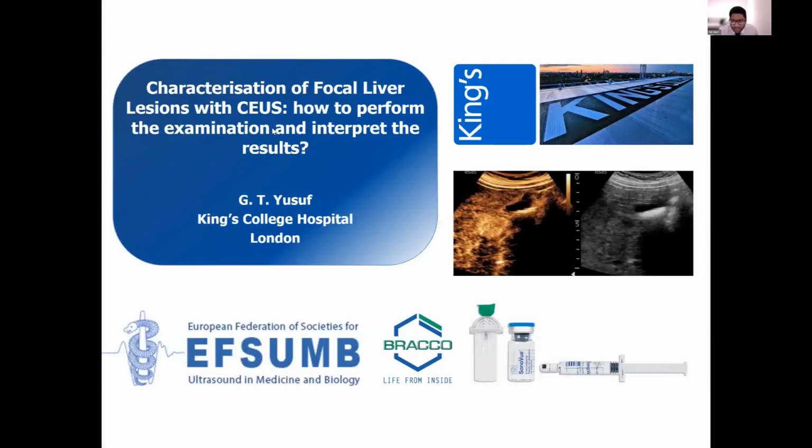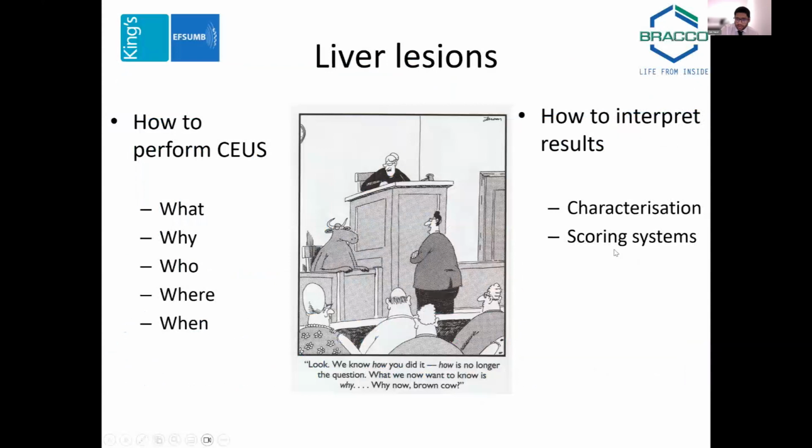Thank you for the welcome. So I'll be speaking about characterization of the focal liver lesion with contrast enhanced ultrasound, the examination, and how to interpret the results. And I'll recap some of what we've heard a little bit already as well. So where Professor Sidhu has finished, I'll start off.